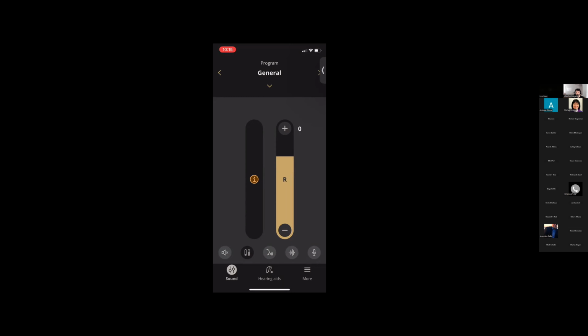So those are kind of the softer sounds, the sound of like a kettle, or a violin. Some of the higher pitches of a violin are very hard for me to hear. So my prescription says, okay, well, 0 is where we want to be.